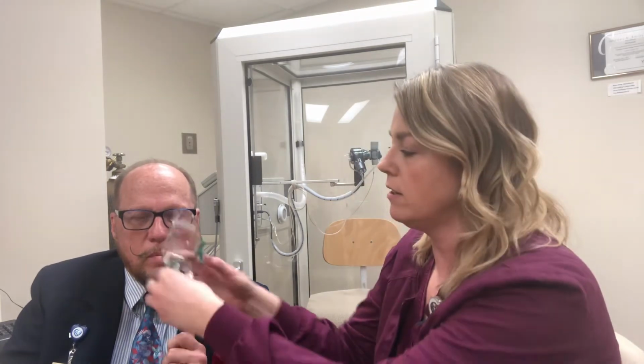The treatment takes anywhere from 8 to 10 minutes. You'll notice the drug will start to kind of sputter at the end. We give it a little shake, maybe not on their face so it doesn't hit them, but if it's a mouthpiece, it's really easy because we shake it and then give it back to them. So about 8-10 minutes till it's gone, and then take it off and do your assessments again.